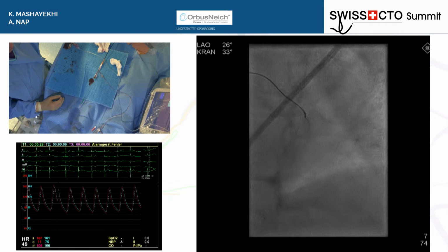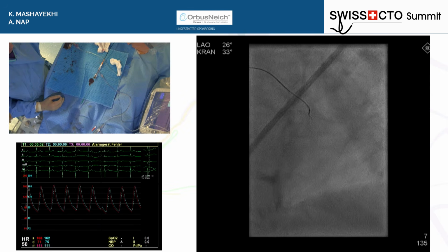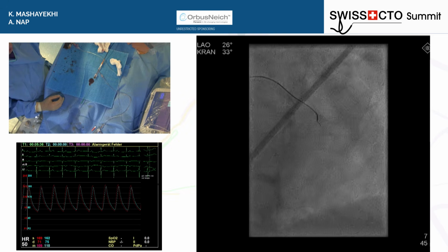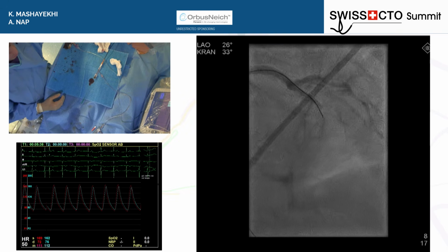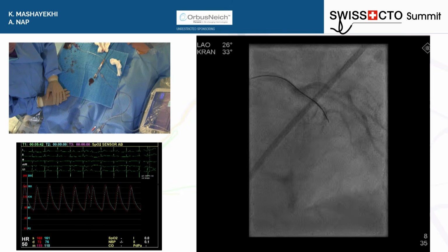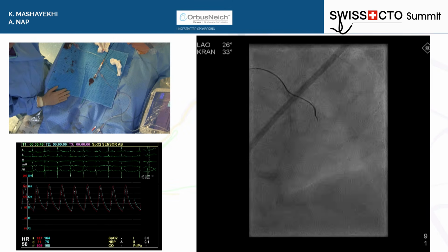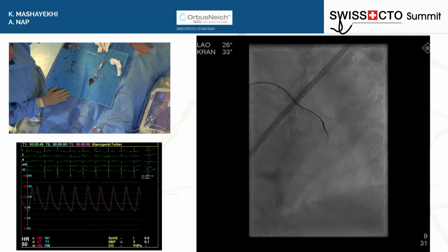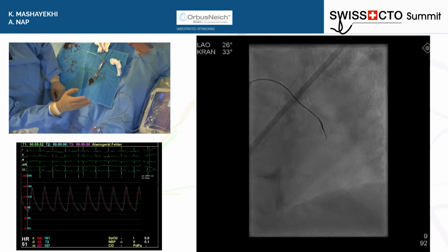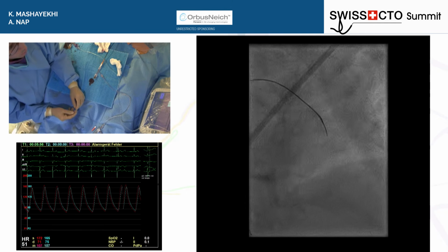You see here that the Teleport catheter is coming back. There's a lot of friction, a lot of resistance in this cap. So therefore I stepped up to the next wire, which is a Gaia Third. And with the Gaia Third, at least I could penetrate the cap. And now it's getting interesting. How will this wire behave? We are at this position here, and already the wire is deviating a little bit towards the left. And this is where we are. So we are live now.